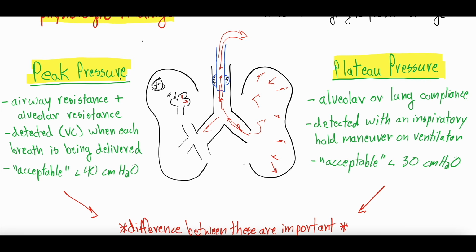is the pressure the ventilator is experiencing when it tries to push a breath into the lungs. So ponder that for a second, right? This is a closed circuit, right? This endotracheal tube ends up coming out of the patient's mouth, and then there's tubing that weaves away onto the ventilator itself. But this is a closed circuit. It's not open to the external environment, right?